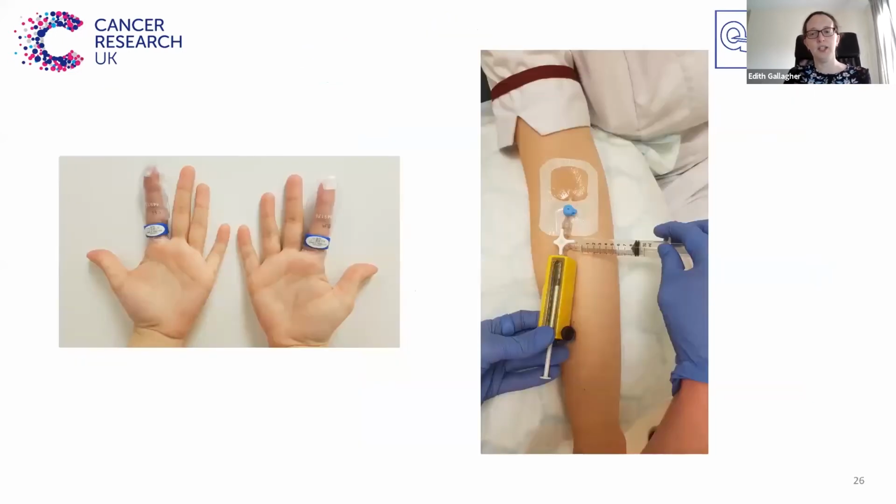All staff that work in nuclear medicine and PET-CT are monitored to check how much radioactive exposure they are receiving. One method of doing this is by using finger monitors. On the left, you can see 2 finger monitors being worn, one held at the top of a plastic sleeve over the finger and the other in a ring at the base of the finger. These would be worn underneath gloves, and it has a noticeable impact on finger dexterity.